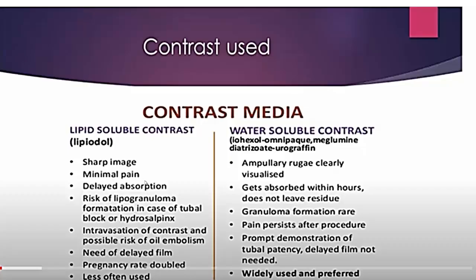There is delayed absorption with the oil, while here the absorption is within hours. There is a risk of lipogranuloma formation in cases of tubal block or hydrosalpinx. In the water-soluble contrast, granuloma formation is rare.